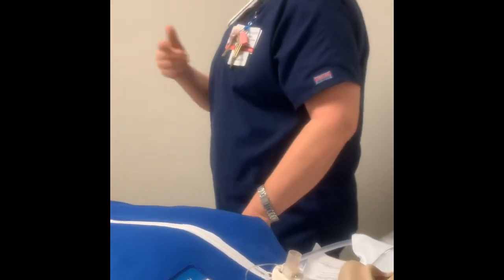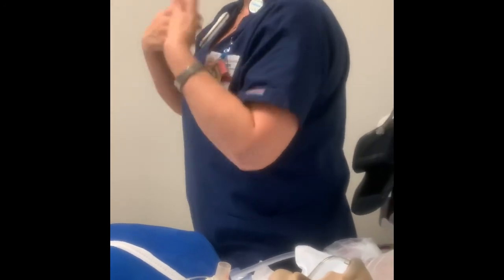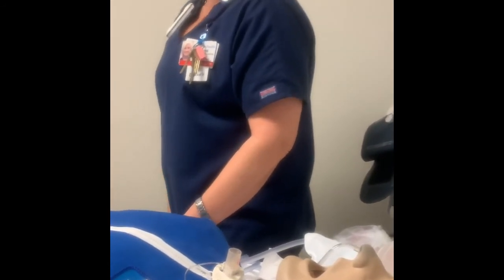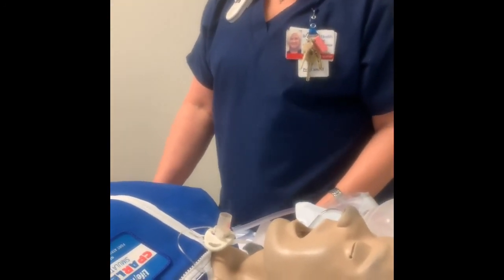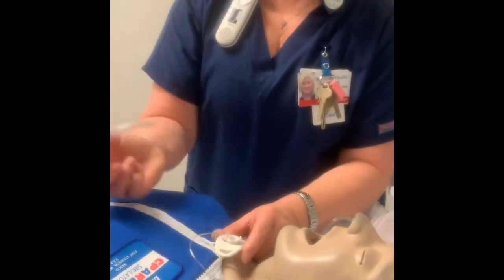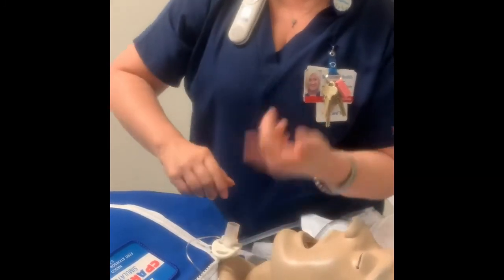And even when you're messing with this trach up here, when you're cleaning it, even after you suction them, it's still going to stimulate them to cough more, and then there's more stuff coming up. And when you're taking the cannula out to clean, the whole thing's still open, so they're still able to breathe as you're cleaning. It's not like a rushed thing. You just take this out and you still have the hole. Everything is fine, and they're perfectly okay.